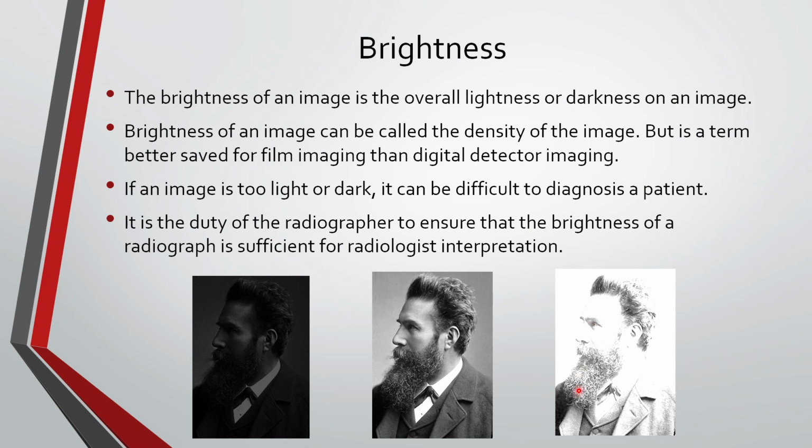This one here is really light. Even though maybe we can see some detail here that we couldn't see before, we can't see any detail in the face, and all that. So this is pretty obvious, right? We need a nice brightness on the image, without it being too bright or too dark.